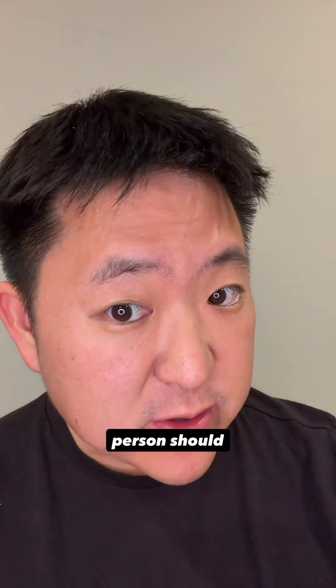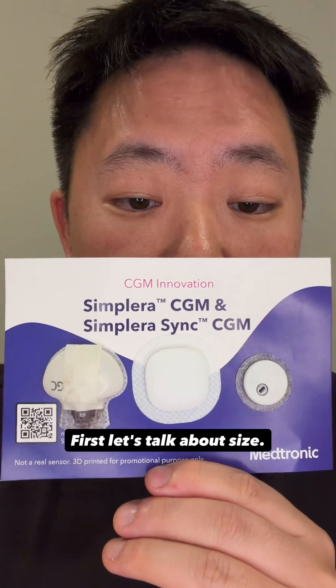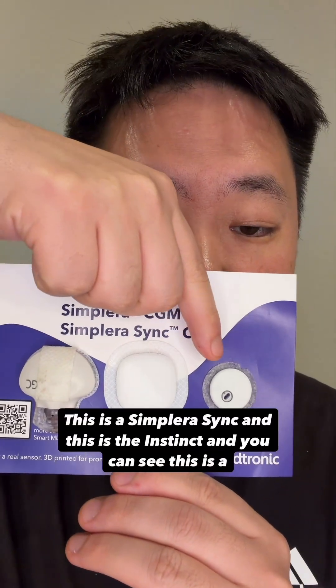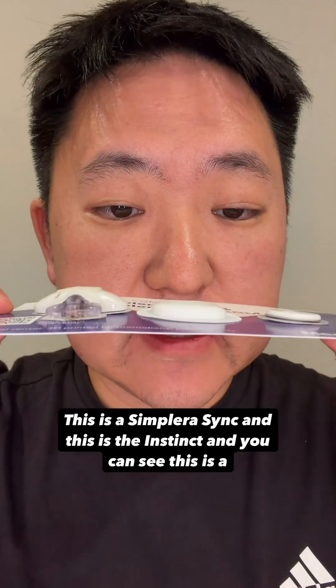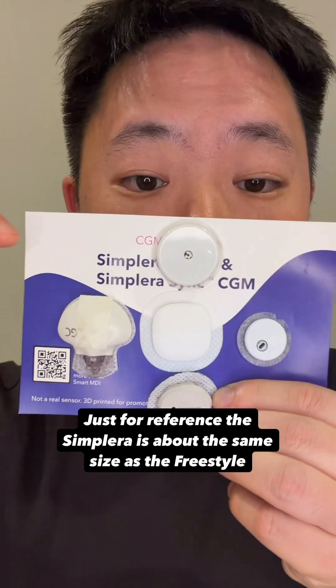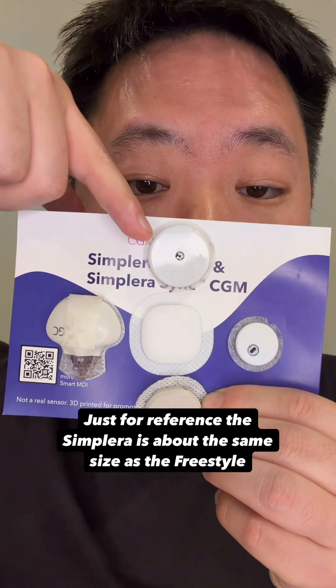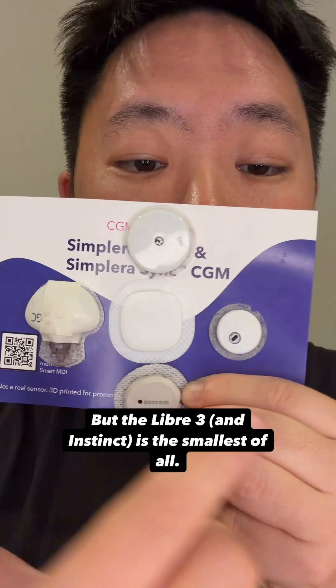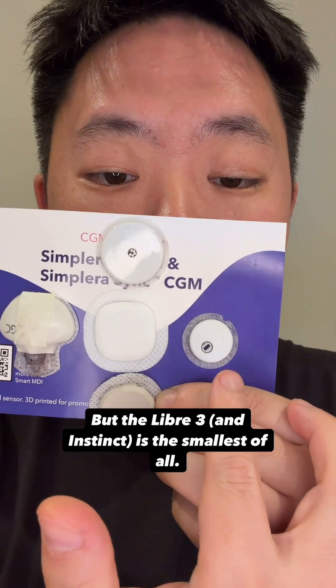Let's break down their differences and I'll explain why most, but not every person should pick the Instinct. Let's talk about size. This is the Guardian, this is the Simplera Sync, and this is the Instinct — and you can see this is a side profile. Clearly, the smallest sensor is the Instinct. The Simplera is about the same size as the Freestyle Libre 2+, and a little bit bigger than the G7, but the Libre 3 and Instinct is the smallest of all.